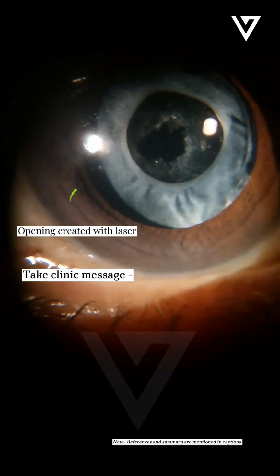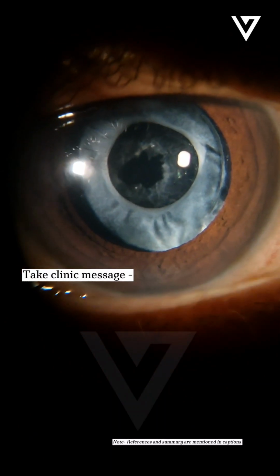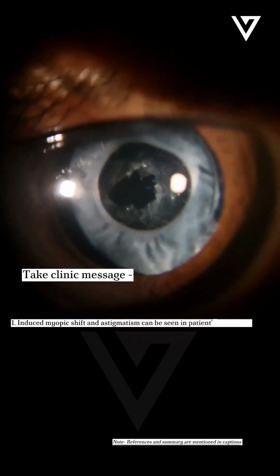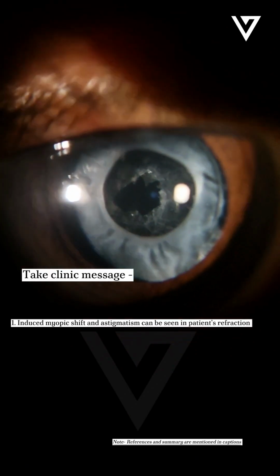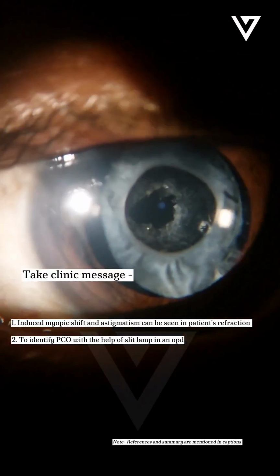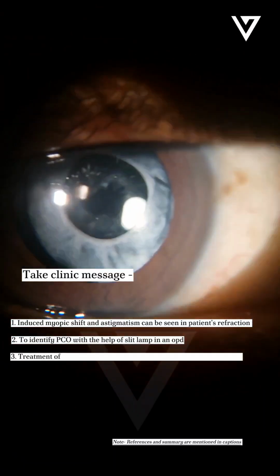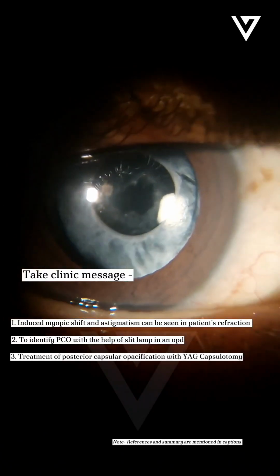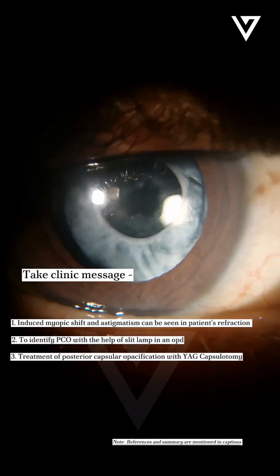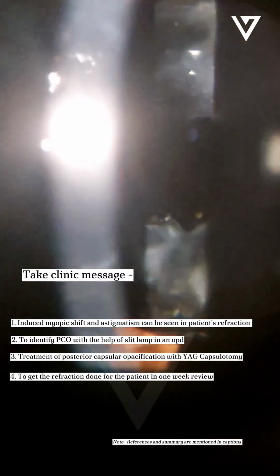So basically, if we talk about the learnings from the session, I believe we have understood about PCO, the induced myopic shift and astigmatism due to capsular opacification, and also we have seen visual representations of PCO so that everyone could understand looking at PCO how it looks exactly. So we also understood how PCO is treated with YAG machine with the help of a procedure called YAG capsulotomy. Let us also remember to get the refraction done for the patient in 1 week review so that patient gets the crystal clear vision, which is all at the end of the day we are chasing.